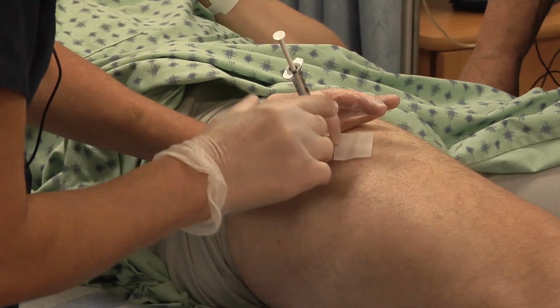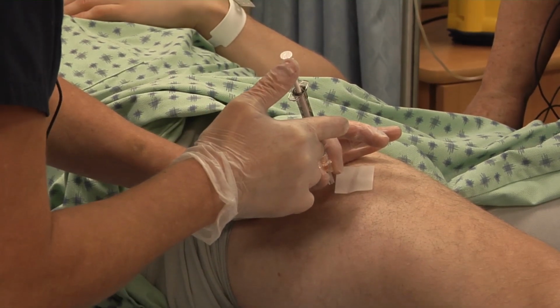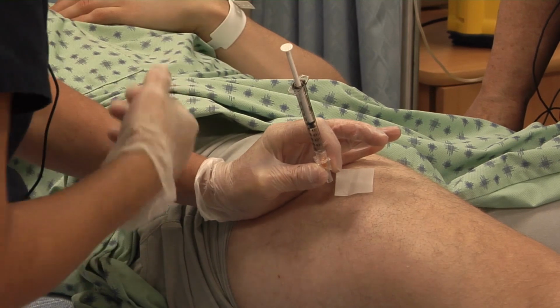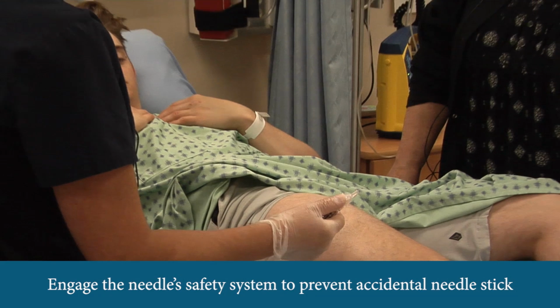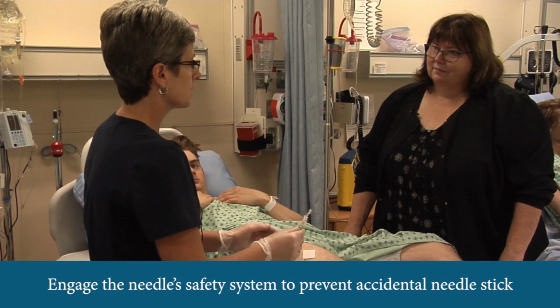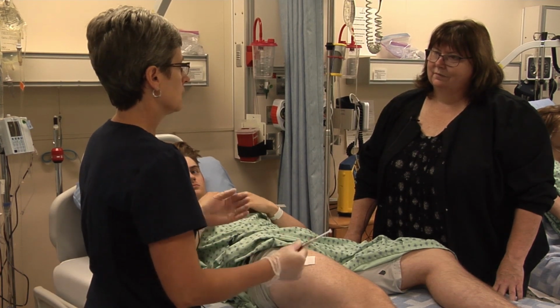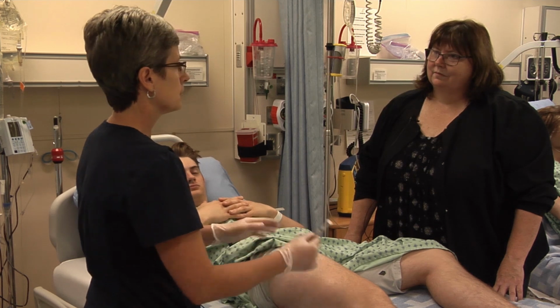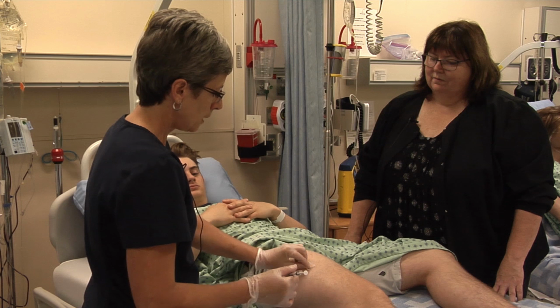Yep, and I'm probably going to say, sir, just wiggle your toes while I'm injecting. Or if you're able to, you engage in conversation. What I find is oftentimes students have to concentrate on one skill at a time, but with time, eventually you'll be talking about the garden and the dog and the weather and the kids and going about your tasks all at the same time. Okay, so I've left the site.